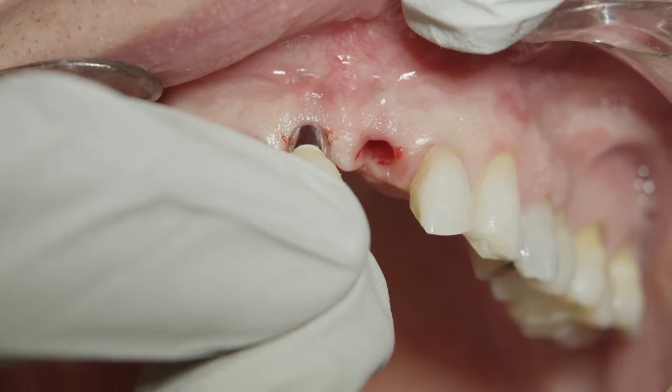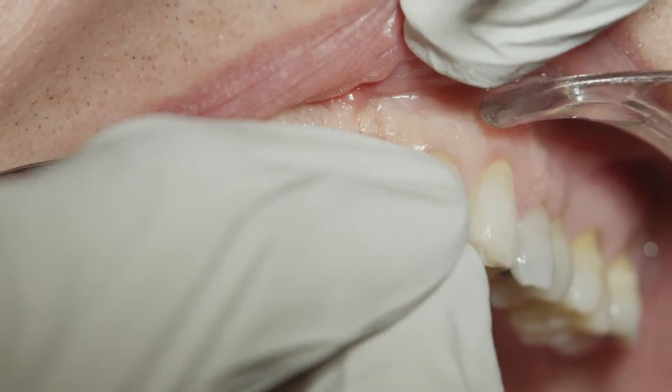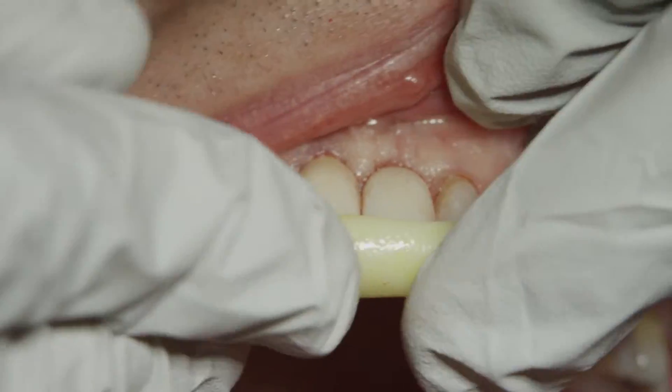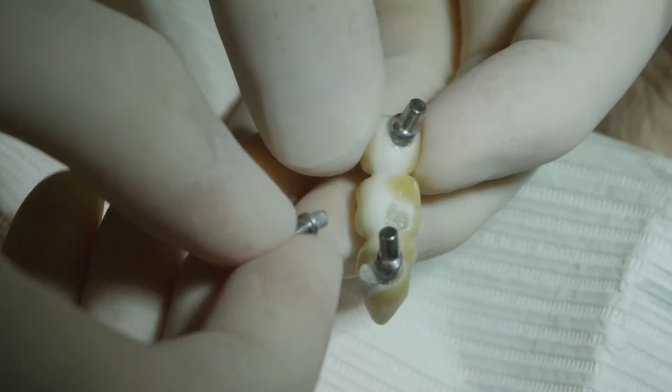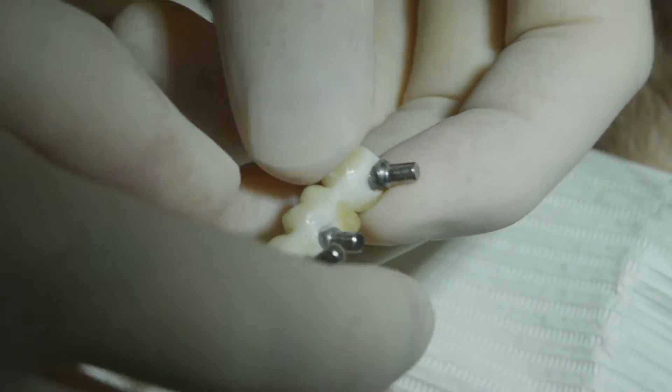If you're inserting multiple single crowns, a jig can also be made directly over these crowns and adjacent teeth. If inserting a bridge, the bridge itself can be your jig.